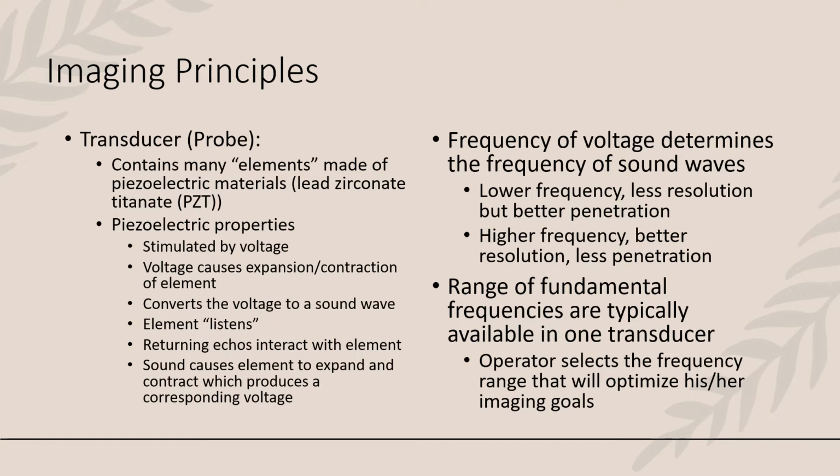As we talk about principle 1, it's important to note the important components of our imaging transducer. The transducer, as you all know, I'm sure, is the name for the probe which we hold in our hand while we scan our patient. That transducer can be a number of different shapes, as we'll talk about shortly, but the idea that's similar to all of our transducers is that the transducer consists of a number of different crystals or elements, and each of these crystals or elements operates off of that principle 1, where each element is able to produce a sound wave and listen for an echo, collecting information to then apply to the image.